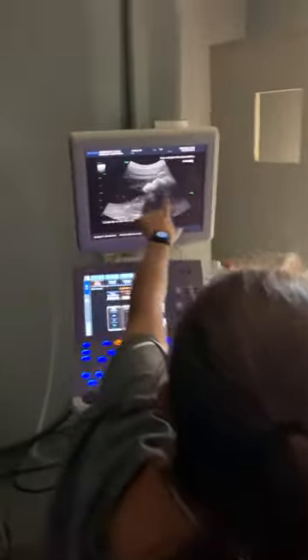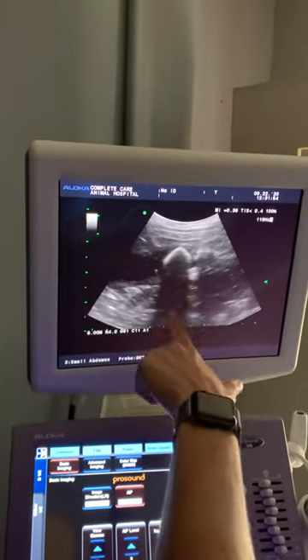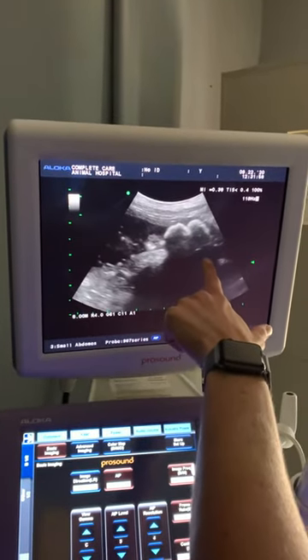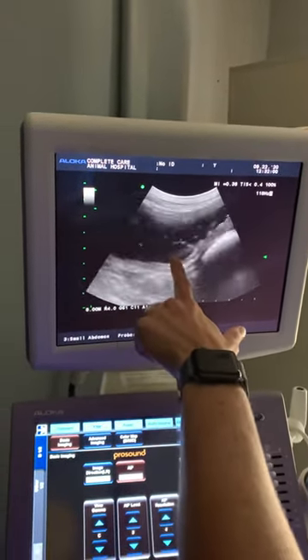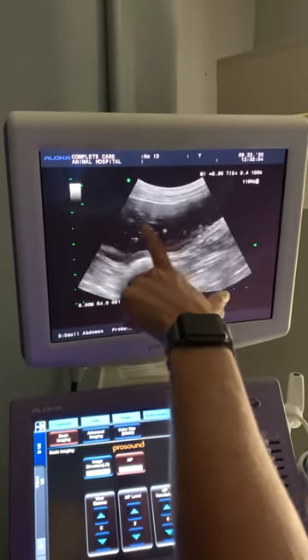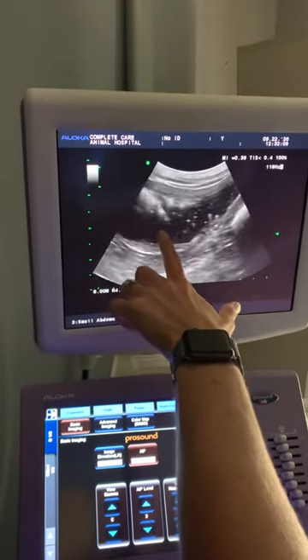This is why we want to ultrasound when we have a dog with urinary symptoms. This is a little schnauzer, and if we look here on the screen we can see these are stones. We can see that they shadow, and that shows us that we have mineralized debris. If you look here, floating — kind of shake it up a little bit — see all that swirly stuff? We've got quite a bit of debris, and these are very likely to be struvite stones secondary to infection.